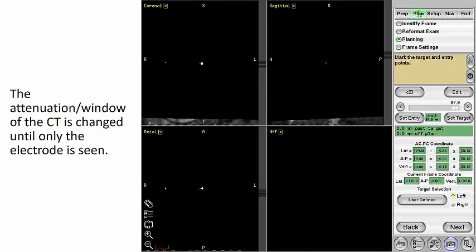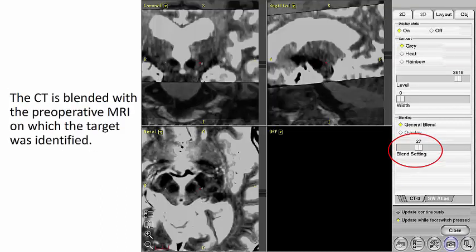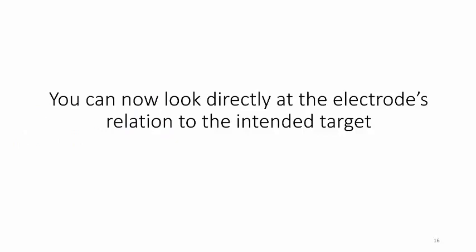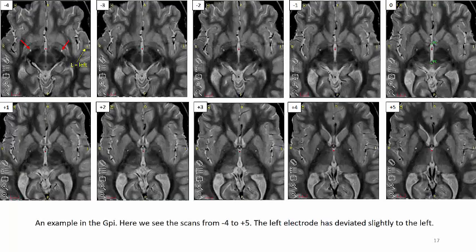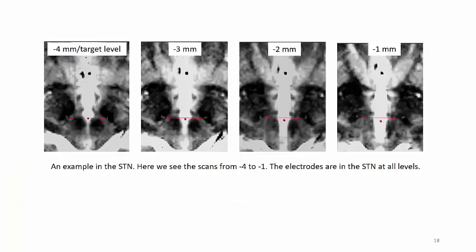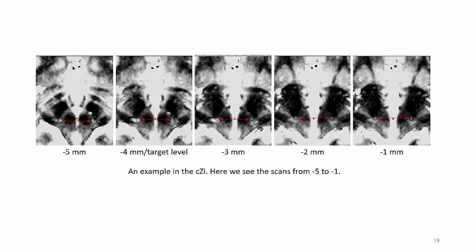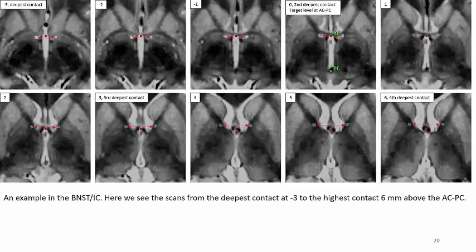The window of the CT is then changed until only the electrode is seen. The CT is blended with the preoperative MRI on which the target was identified. You can now look directly at the electrode's relation to the intended target. Here we have one example in the GPi — we see the scans from 4 mm below the ACPC level to 5 mm above. Another example in the subthalamic nucleus. An example in the caudal zona inserta. And finally, one example in the bed nucleus of stria terminalis and internal capsule.